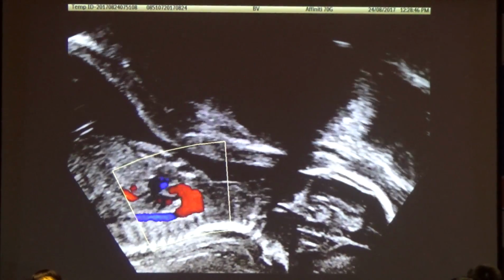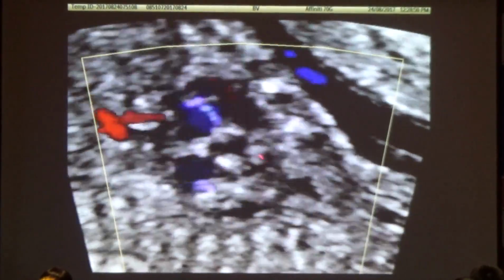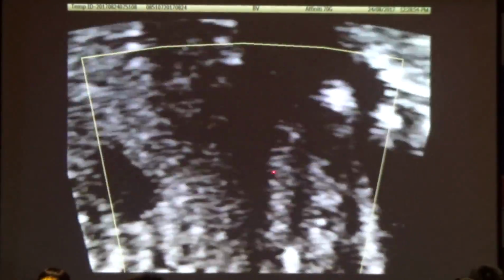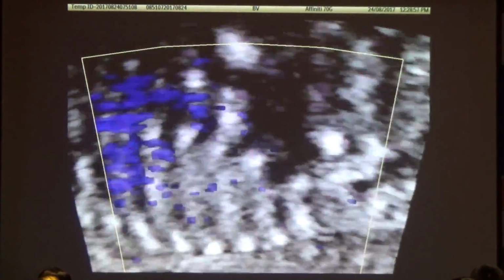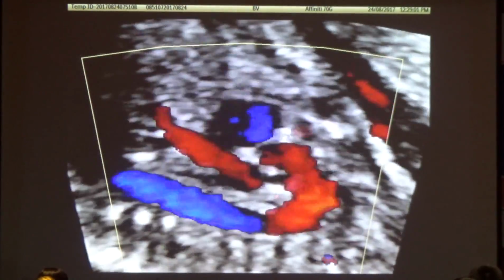Alright, now let's zoom the image. Okay. So there's the aortic arch, eh? Beautiful. Great, okay? Alright, we'll say that to the mother, eh? Okay, we sort it down here, eh? I think let's get somebody else in here.